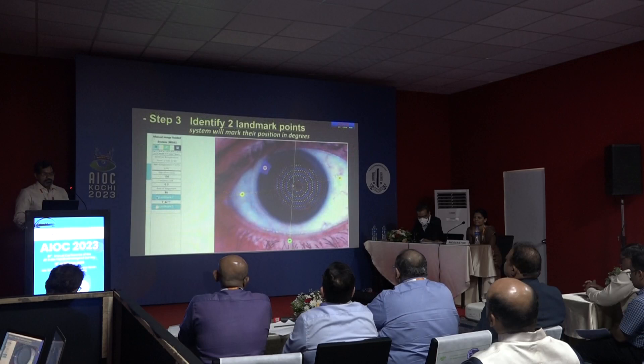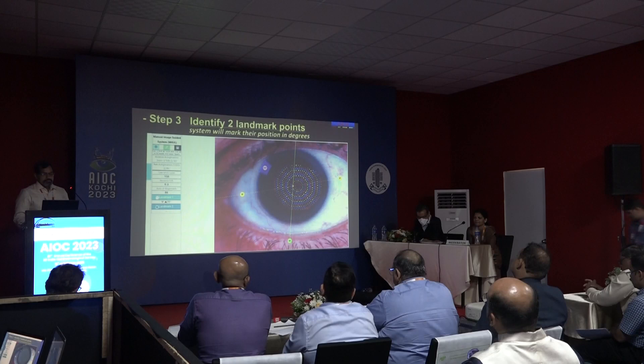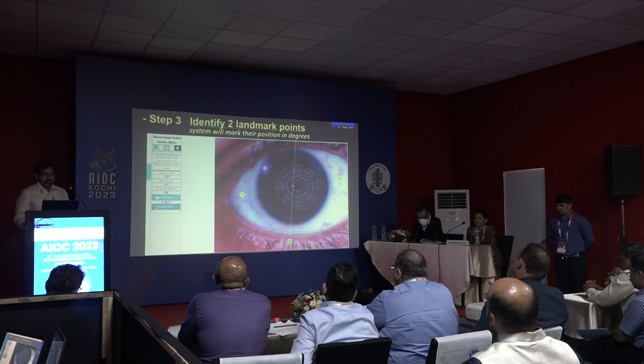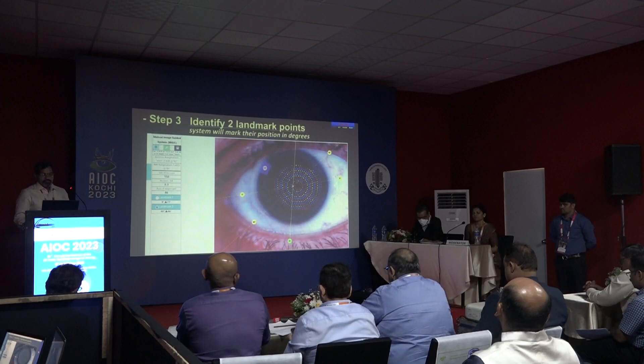Step 3: Identification and marking of 2 landmark points. The system enhances the topography picture to make limbal structures more prominent. The surgeon selects 2 prominent limbal structures or blood vessels, marks them by touching the screen, and the system automatically marks their axis in degrees.